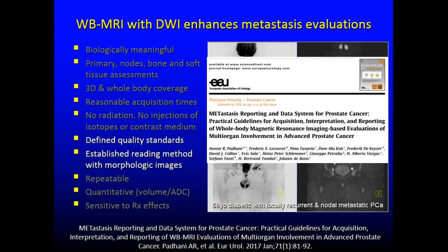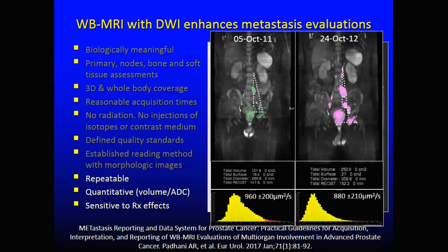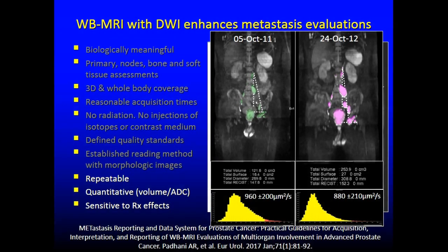We now have quality standards published in 2017, and we have an established reading method for which to be able to report these scans. These scans are repeatable and they are quantitative, but furthermore, they are sensitive to therapy effects.